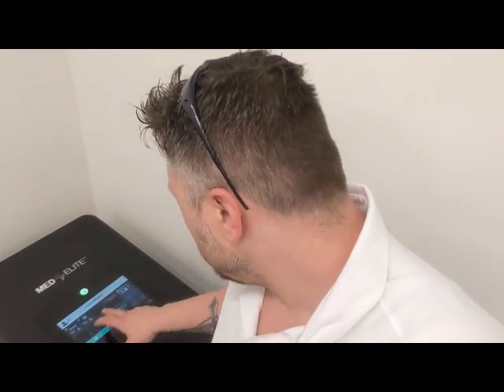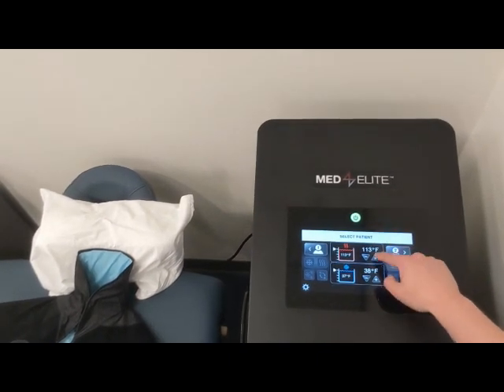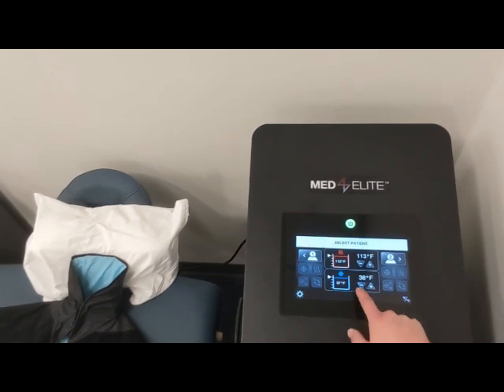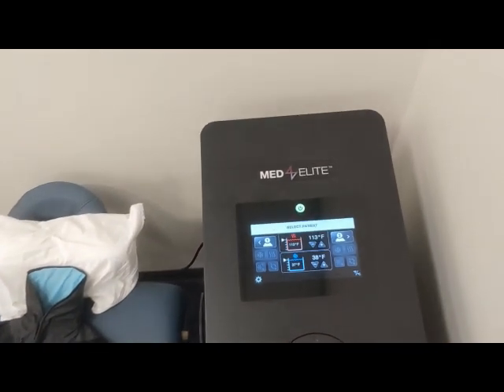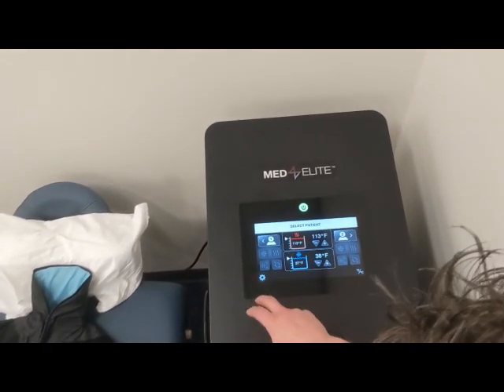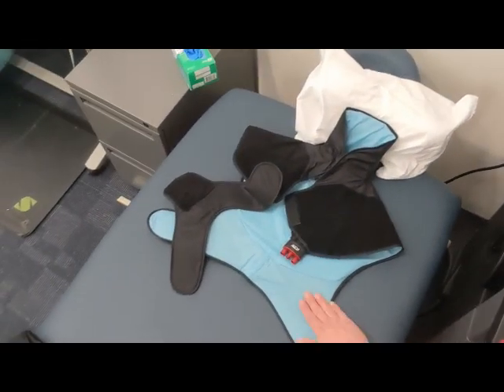I've already set up the compression system on my back and made the connection from the dongle to the Med4. I'm going to walk through the system of setting it up. This is the main screen you should see. It's already preset to the hottest and coldest settings. Now that I've set up the first apparatus, we'll press one and select cold therapy because this is blue, not red.